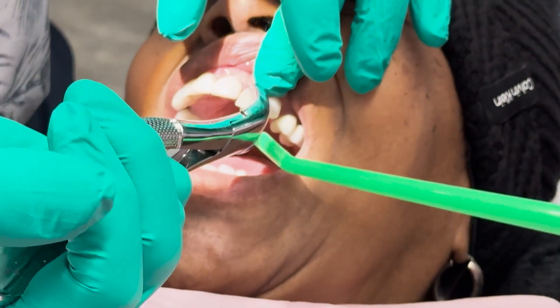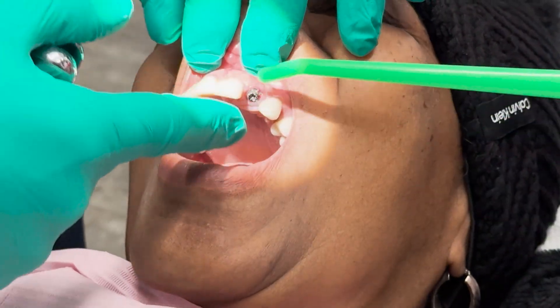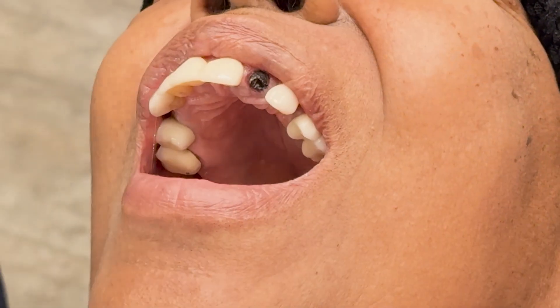All right, honey, here we go. We're going to take that tooth out, okay? The crown's going to come off first. All right, and there's the root underneath that's in bad shape.